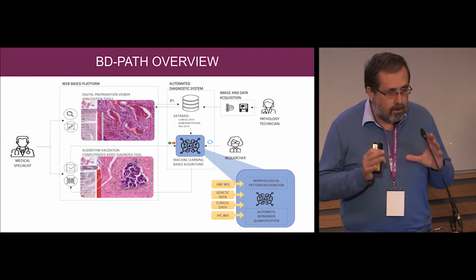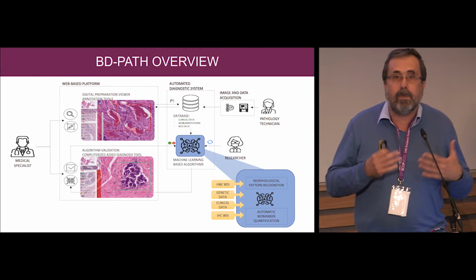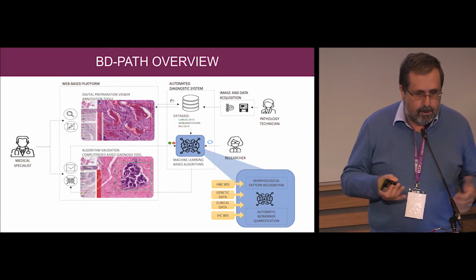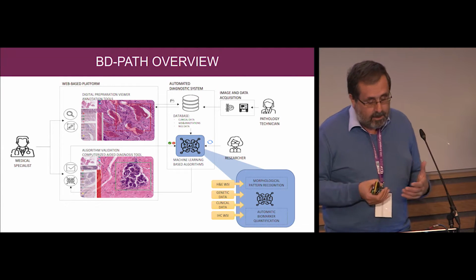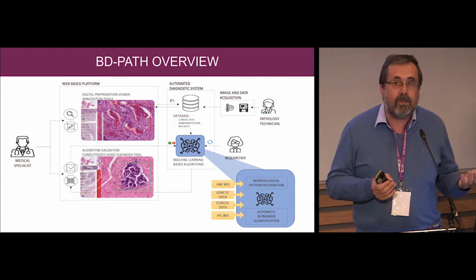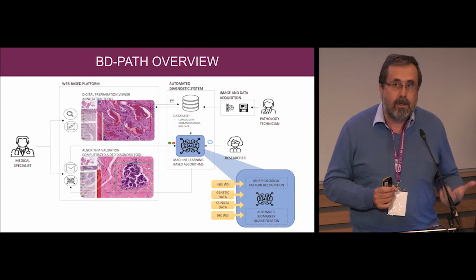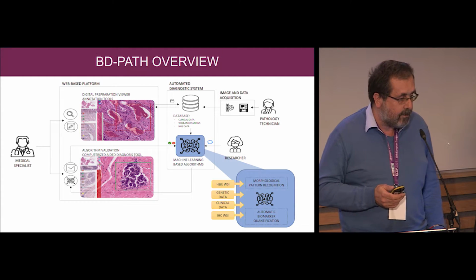The global idea was not only to generate a platform to do annotation, or a platform to have a very good deep learning platform, but our final approach was that in the next step, that we will show later, we want to integrate and correlate not only with clinical data, but also with genetic data that we are collecting from these cases.